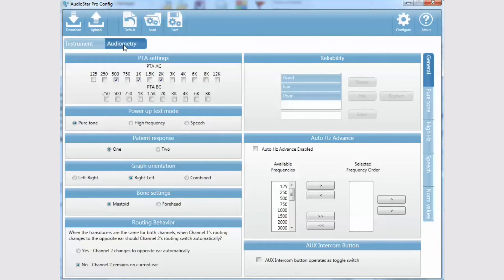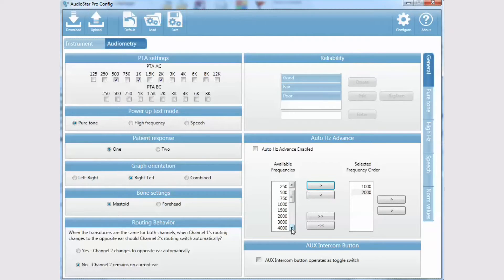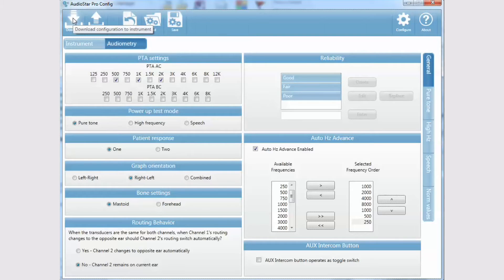Click on the Audiometry tab in the configuration software. In the Autohertz Advanced section, select the frequencies in the preferred order for testing. In this example, only the octave frequencies are selected. Be sure to check the Autohertz Advanced enabled box. Once you have configured all options, click on the download button to enable them on the AudioStar Pro.